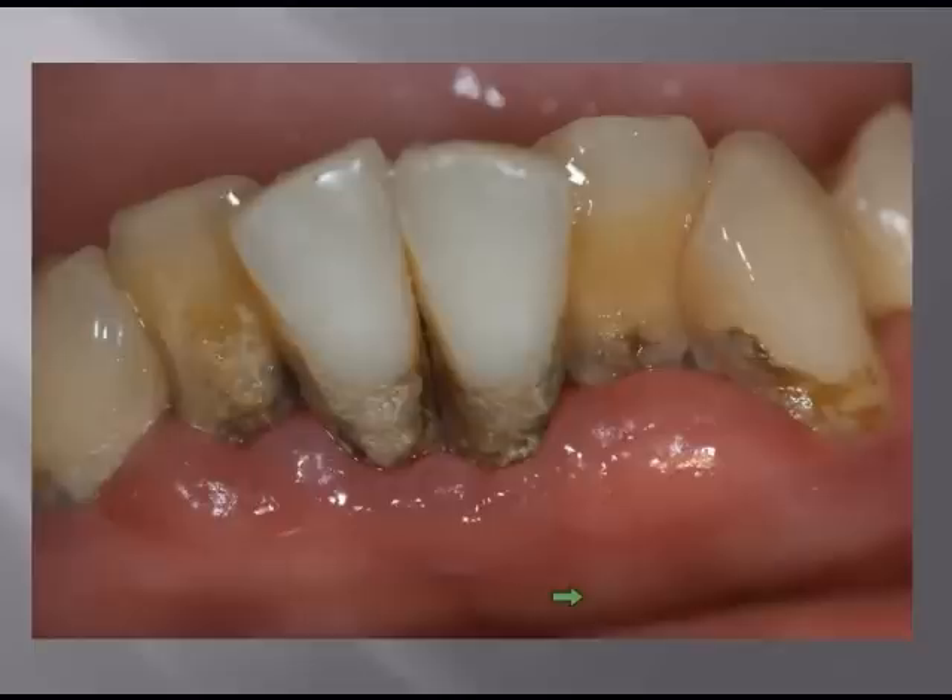If we take a look at this patient here, this is a young man in his early 30s, and these teeth are very, very loose. You can see the amount of inflammation that we have, and I don't think he's even seen a dentist in maybe his whole life, but he wanted to try and keep his teeth.